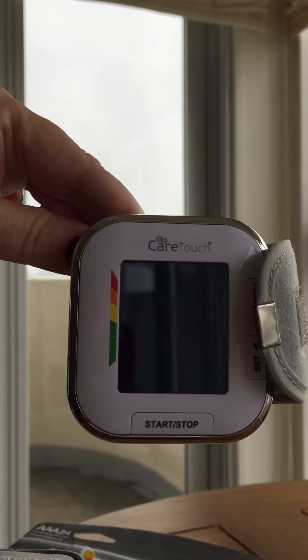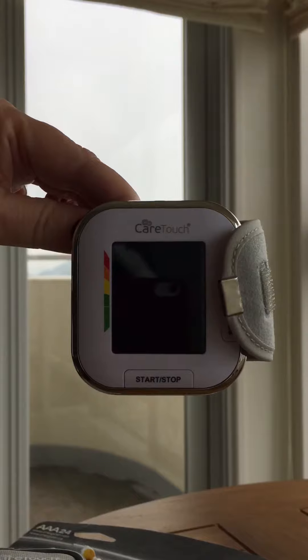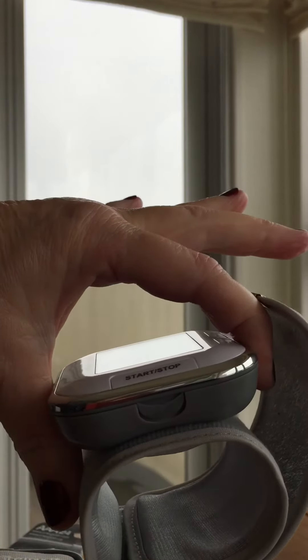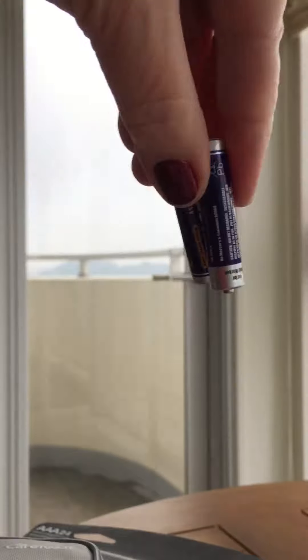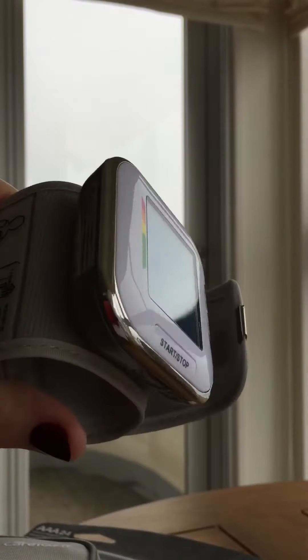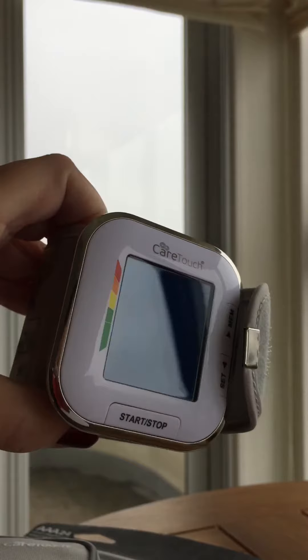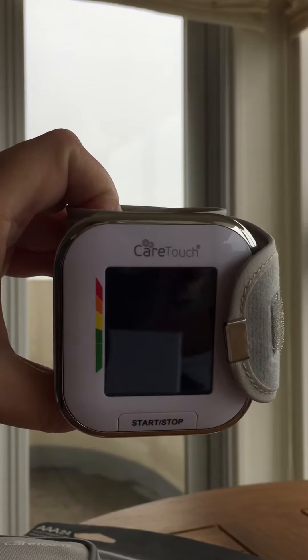This little device goes through batteries like crazy. I showed you the portion where you replace your batteries — I have already gone through one set of AAA batteries, the ones that came with the device itself. Now I'm on my second set, and I'm not leaving it turned on; I'm turning it off in between uses.